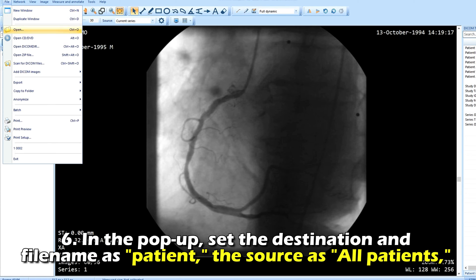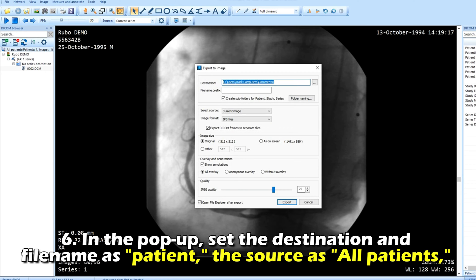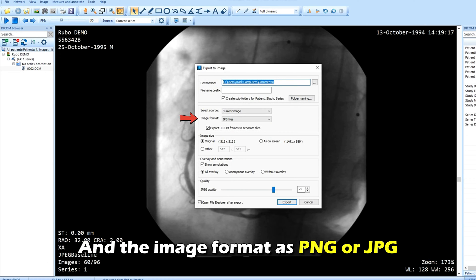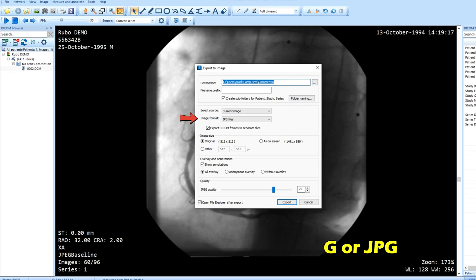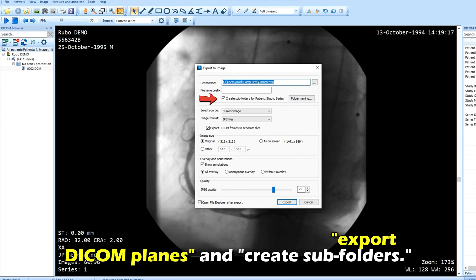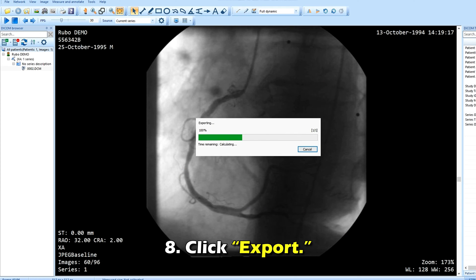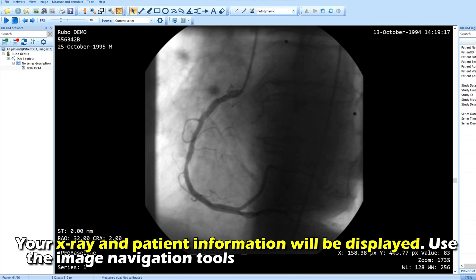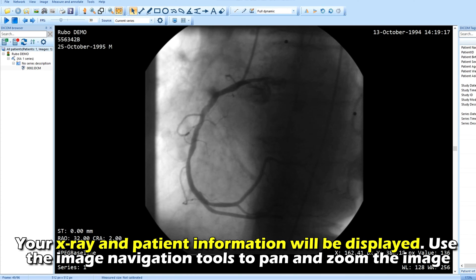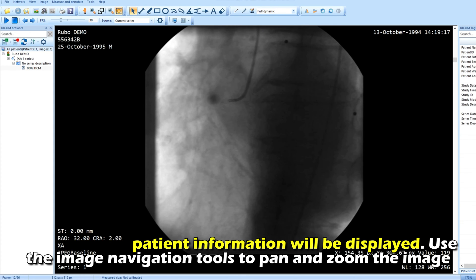Select To a Picture File. In the pop-up, set the destination and file name as Patient, the source as All Patients, and the image format as PNG or JPEG. Uncheck the boxes asking to Export DICOM Planes and Create Subfolders. Leave the image size as original and allow annotations and overlays. Click Export — your x-ray and patient information will be displayed. Use the image navigation tools to pan and zoom the image.